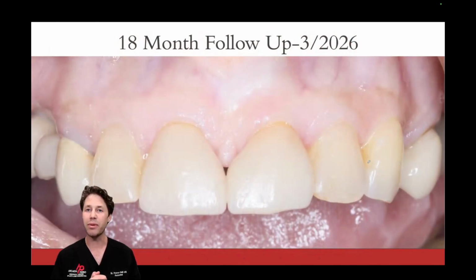Let's look at this 18-month follow-up. Look at the tissue quality. Now, the patient did not want to go through orthodontics, and she wanted that space, that diastema, closed with restorations. All of this was talked about beforehand.